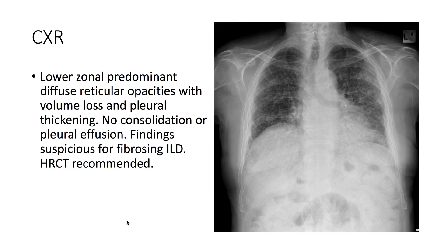Taking a look at the chest X-ray, we note that there are lower zonal predominant diffuse reticular opacities with volume loss and pleural thickening. No consolidation or pleural effusion. These findings are suspicious for fibrosing interstitial lung disease. High-resolution CT is recommended.